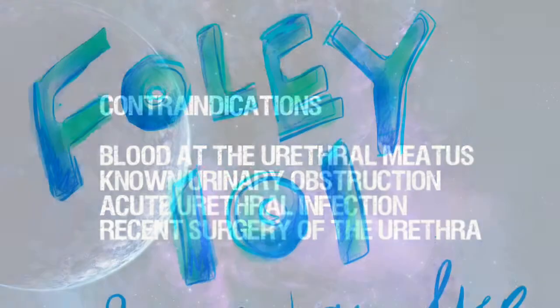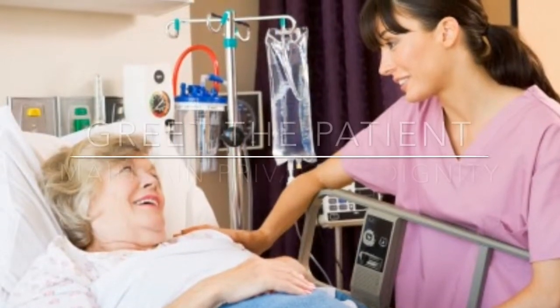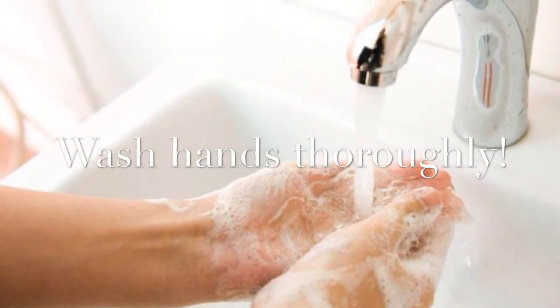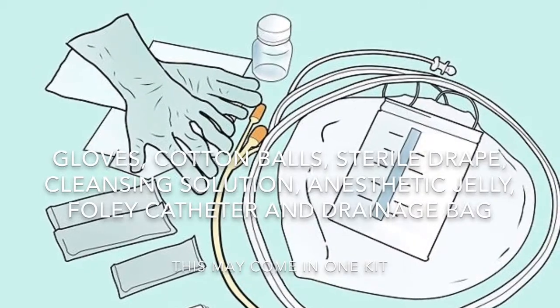Now that we've discussed the indications and contraindications, I will take you through the procedure step by step. Before the procedure is performed, greet the patient, provide privacy, and educate. Wash your hands and ensure that the patient is comfortable. Now it's time to gather your equipment for the procedure.